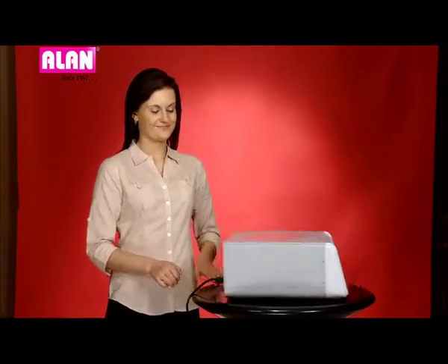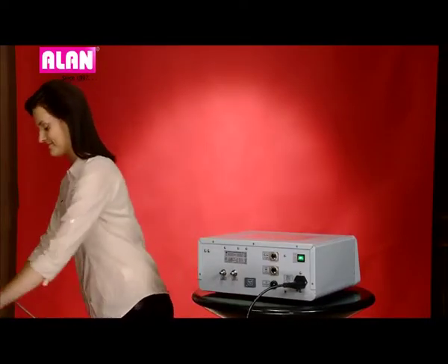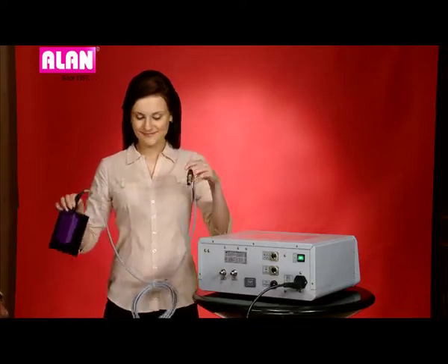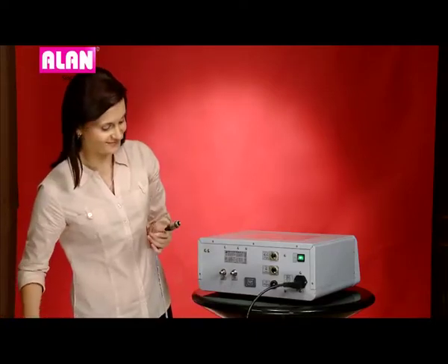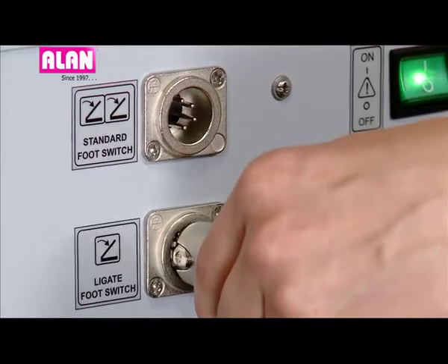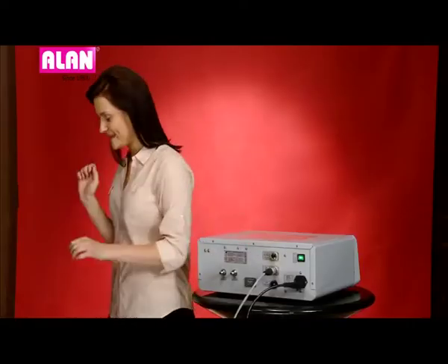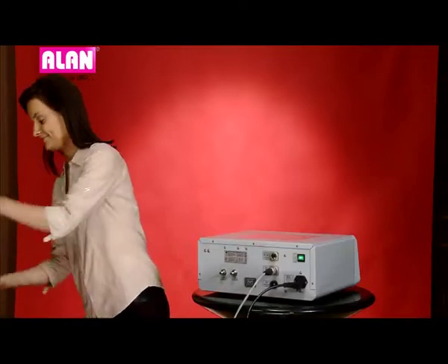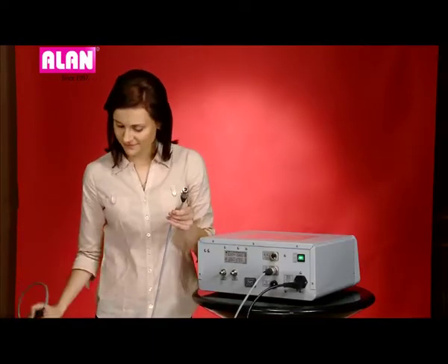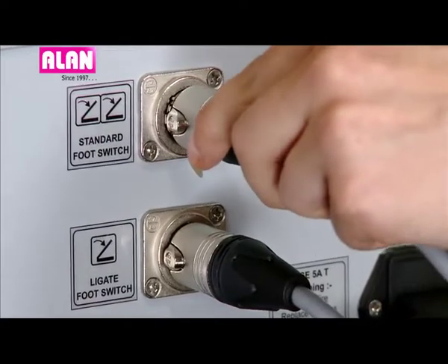Let's see the connection for the foot switch and argon inlets. Single pedal Ligate foot switch will connect to the Ligate foot switch port. Two-pedal or three-pedal foot switch will connect to the standard two-pedal or three-pedal foot switch port.